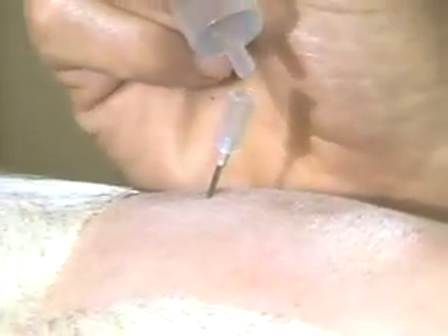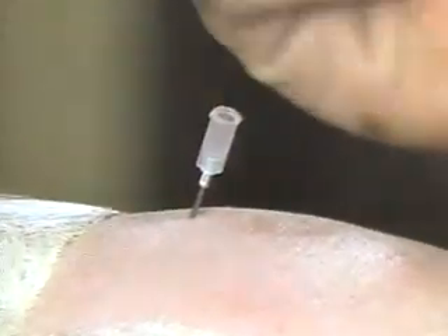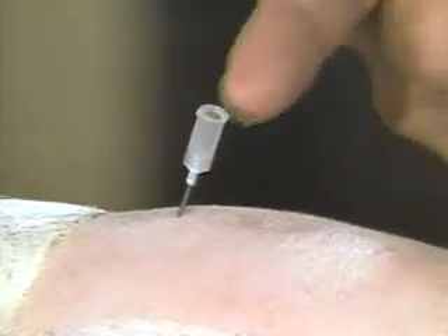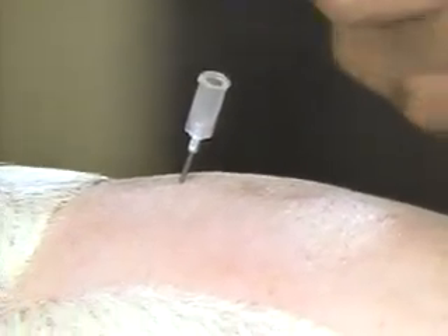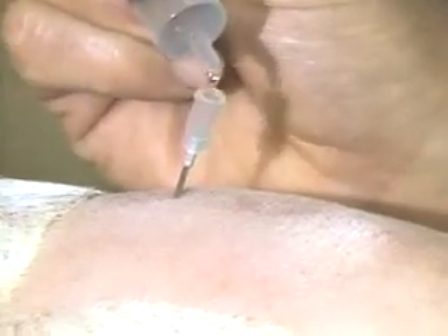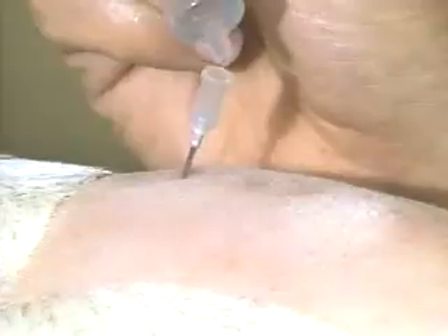One test is to put a small drop of the local anesthetic in the needle, and if it pulls it in — as it did there — almost for certain there's an area with a slight vacuum, and that means it's the epidural space. There I'm putting several drops in; they're all disappearing down into the needle. So that's the correct site.